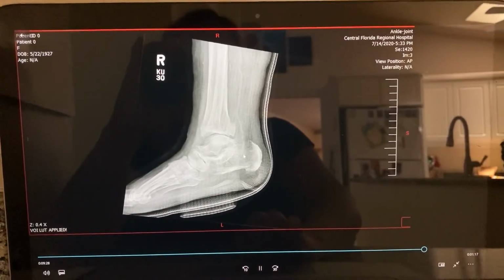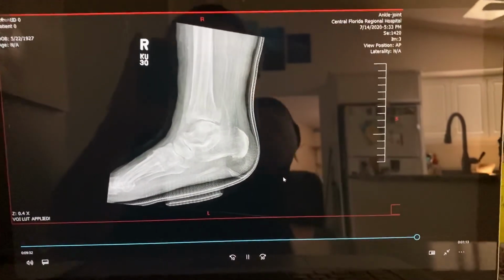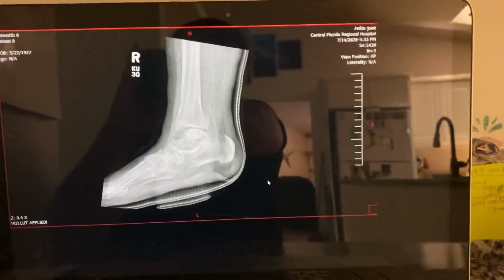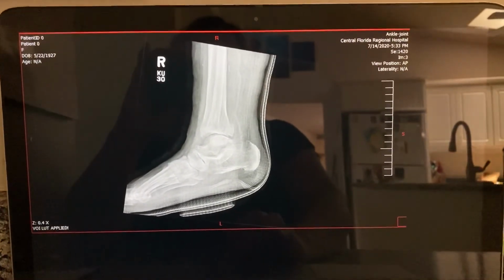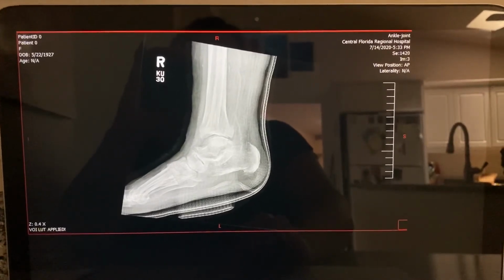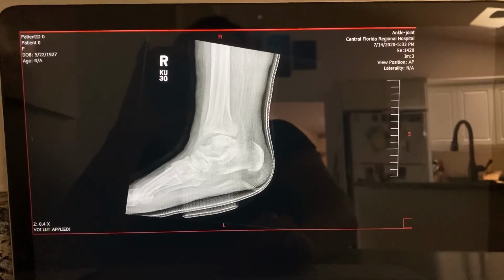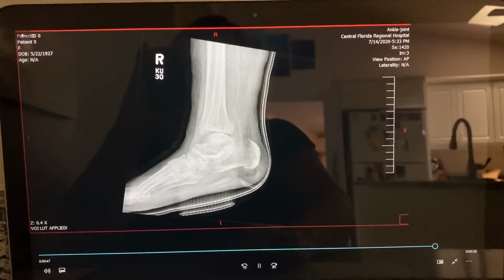However, the patient was unable to attain the true lateral position with the lateral malleolus in contact with the image receptor. Therefore, the patient was rolled to her right hip with the wedge sponge placed near her left hip, and the tube was angled 20 degrees to obtain a lateral and open up the tibiotalar joint.